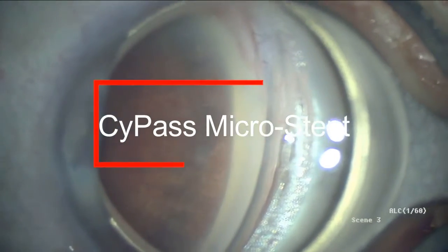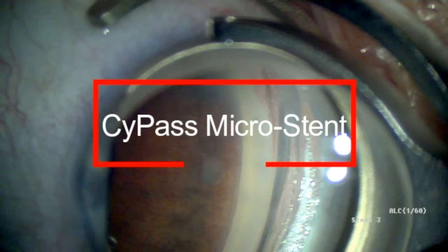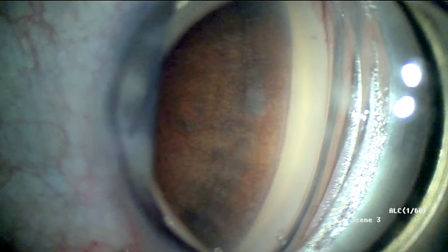This is Dr. Sidney Tyson from Vineland, New Jersey, and I'd like to share with you a video on the implantation of a new microinvasive glaucoma device called the Cypass Microstent from Alcon. The device was approved by the FDA in 2016 for use in patients with mild to moderate glaucoma at the time of cataract surgery.